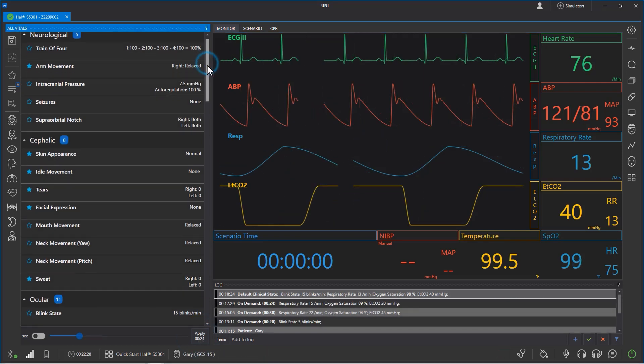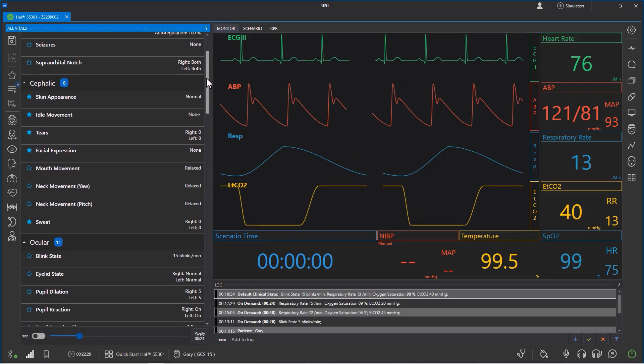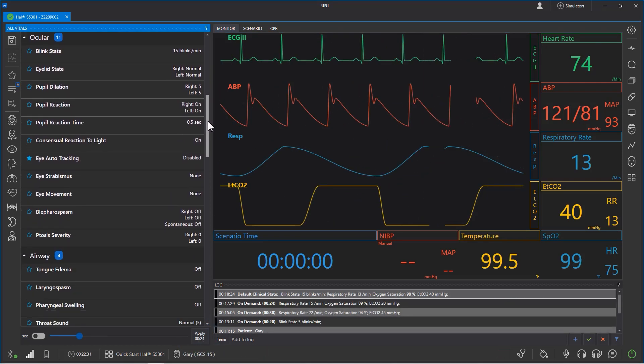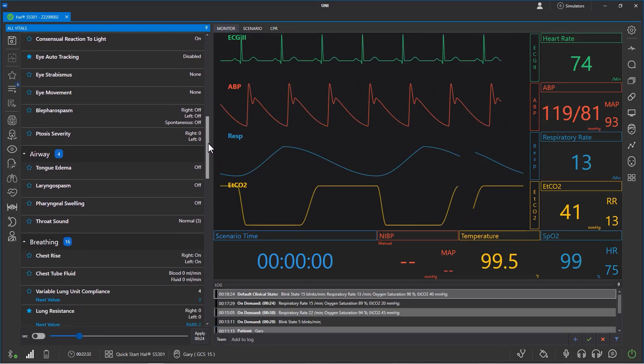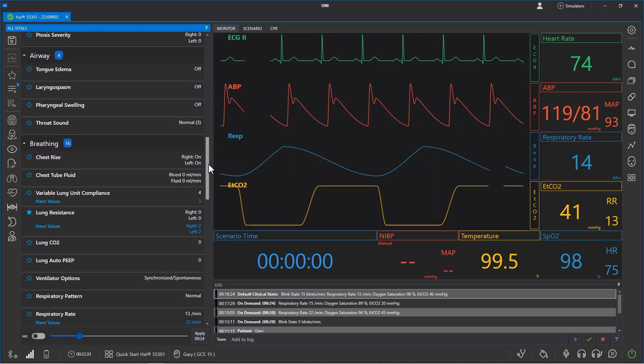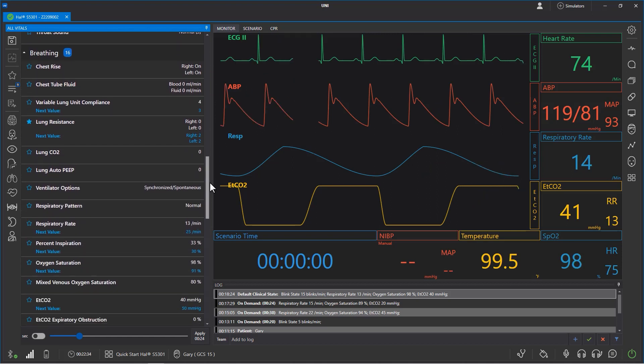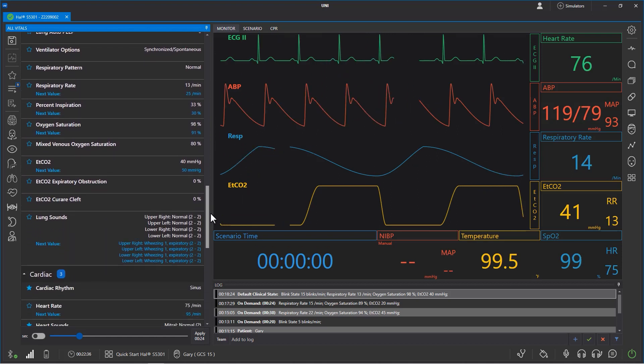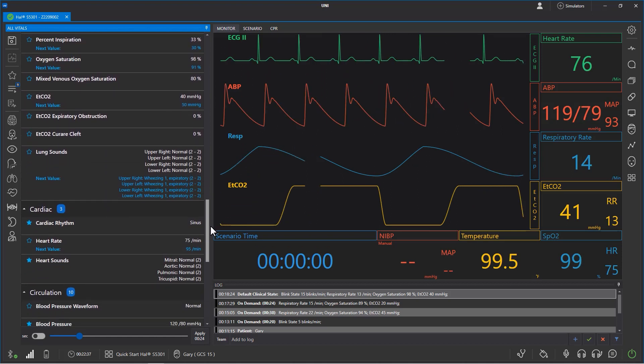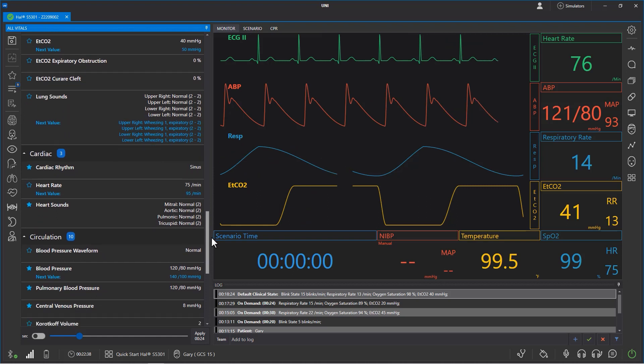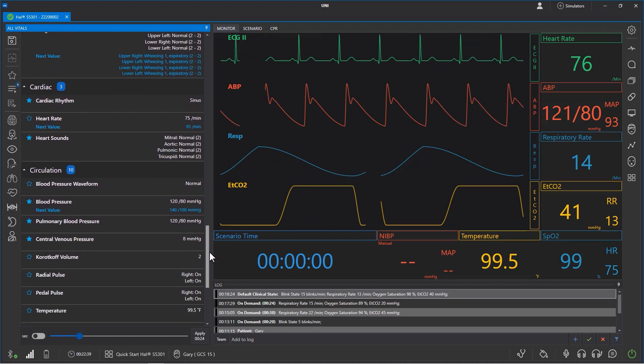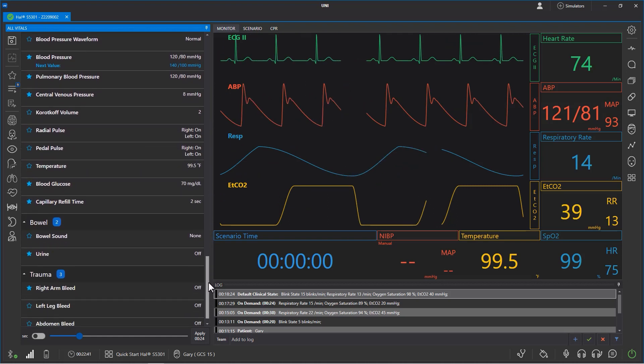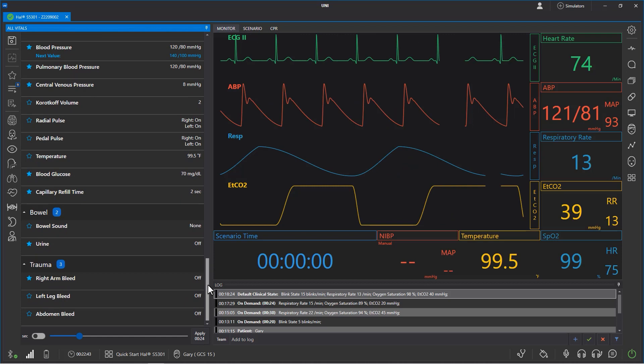Next, let's learn about clinical states. Clinical states facilitate management of intricate simulation scenarios by pre-programming multiple vital sign changes. The result is smoother, more lifelike simulations, enhancing their educational value and simplifying operation.